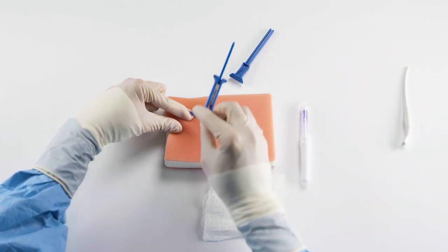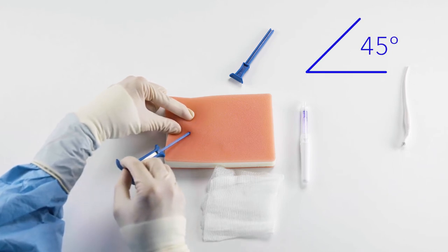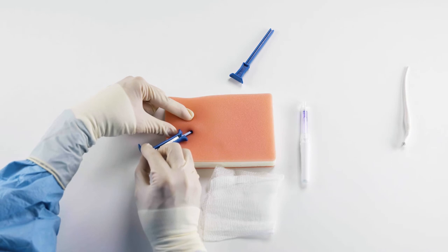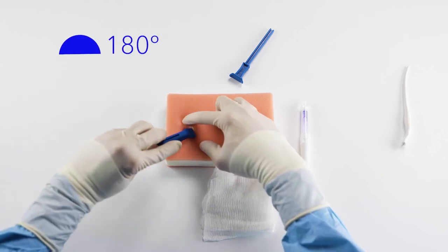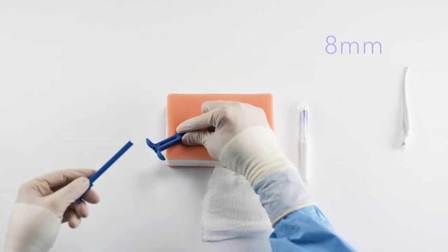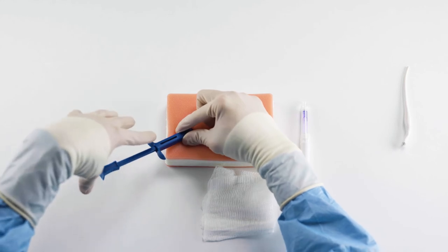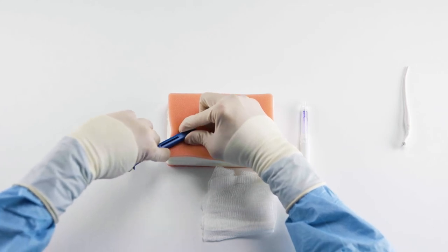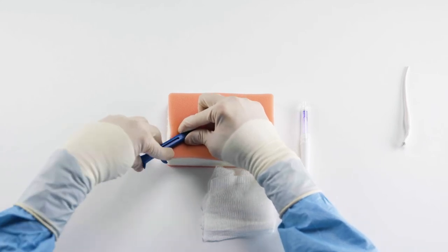I'm going to grab my insertion tool that includes a Medtronic Reveal Link already preloaded, aiming at a 45-degree angle. I'm going to slowly insert this, keeping the tool relatively flat and parallel to the patient's body. Once I'm all the way in, I'm going to flip this 180 degrees, keeping it flat, and now I'm at a depth of about eight millimeters. Using the plunger, I'm going to insert it into the chamber and provide forward pressure with my right index finger and thumb, while with my left hand I push the plunger, inserting the Medtronic Reveal Link into the pocket completely until I hear a click.